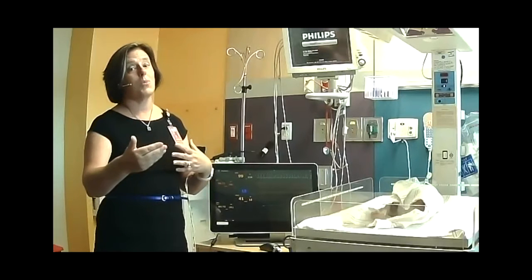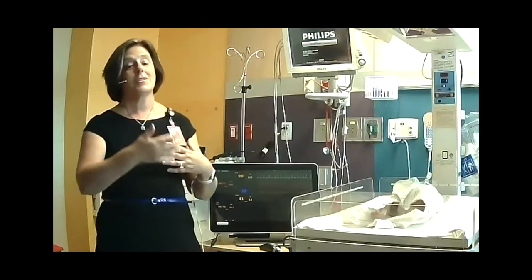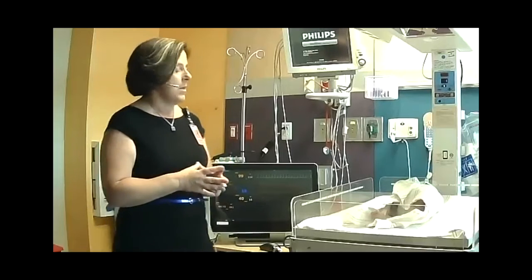That makes sense? Now, when we get low, when we're at 40% of what was sent out, you have to remember that, of what was sent out. So if your baby was 85% to start, it's 40% of 85, or 50% of 85, okay, versus 100. So when those go out, then you have some problems, okay? So that means we've got to do something to make it better. So that's why we'll watch that monitor very closely to see those changes and see those trends.